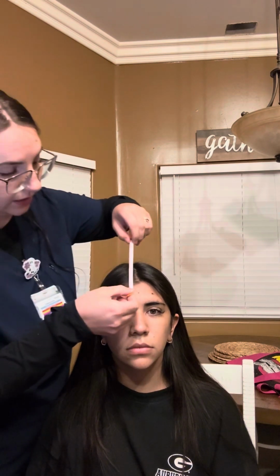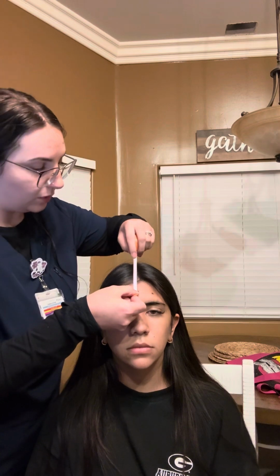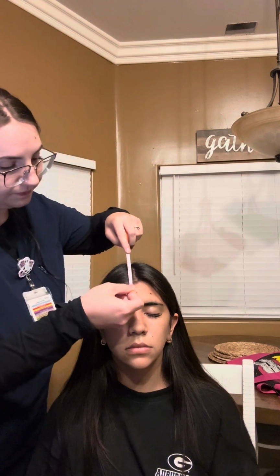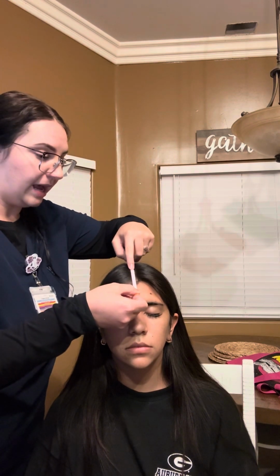Start 0 from here and go to 7.1, which I marked on top of her head. From that one, go 7.1 again, and that gets you your CZ, the very middle of your head.